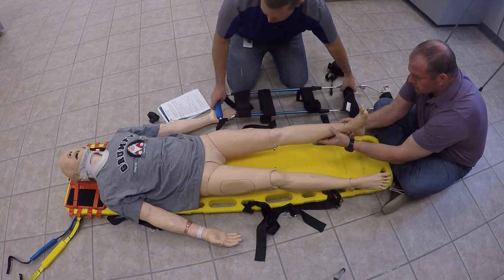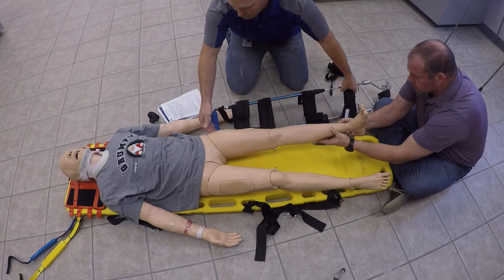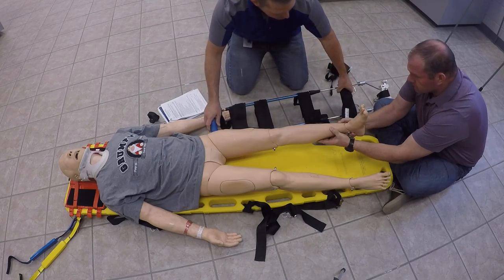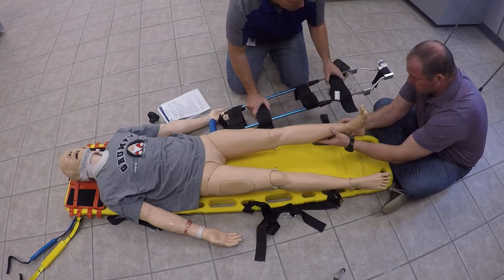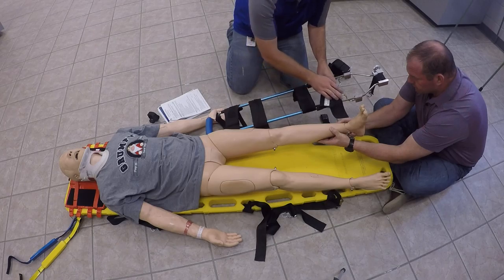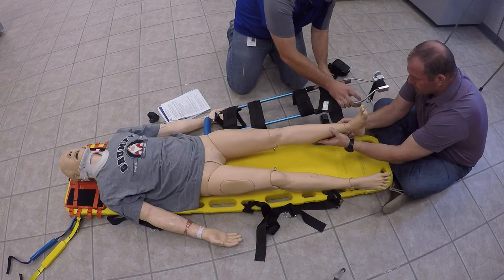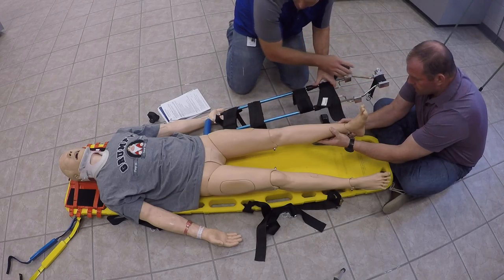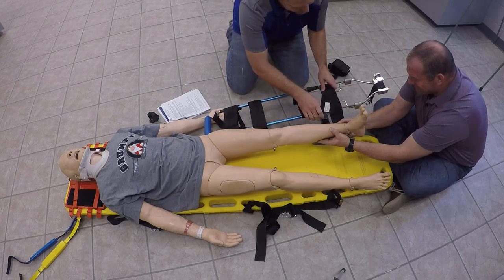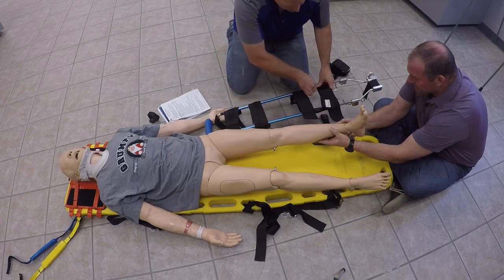We'll go ahead and set our splint up here. We're going to size it appropriately, marking it here from where it'll rest in the hip and then extending outward so that the heel of the foot is at least six inches away from the end of the traction splint. And then you'll tighten that up.